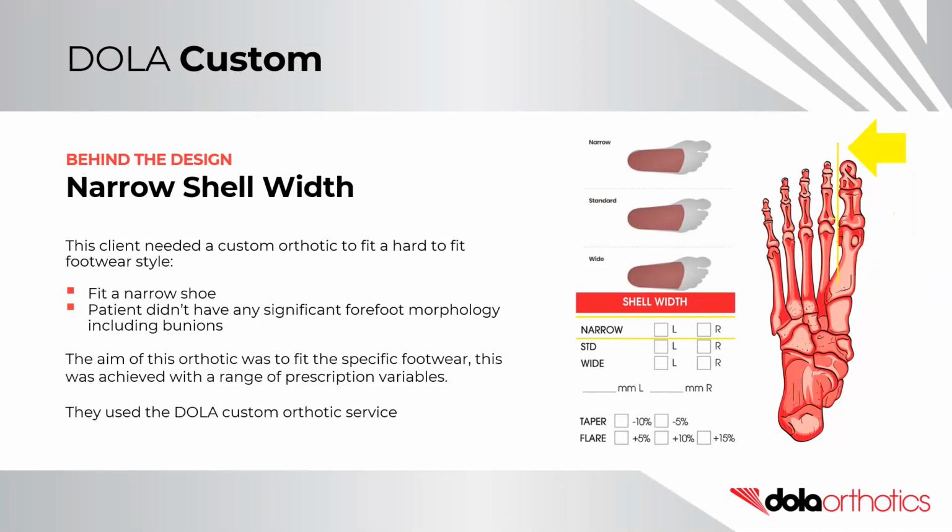Behind the design, narrow shell width. This client needed a custom orthotic to fit a hard-to-fit footwear style. The shoe was very narrow, however the patient didn't have any significant forefoot morphology, including bunions. The aim of this orthotic was to fit the specific footwear.